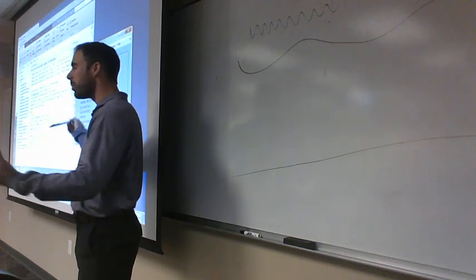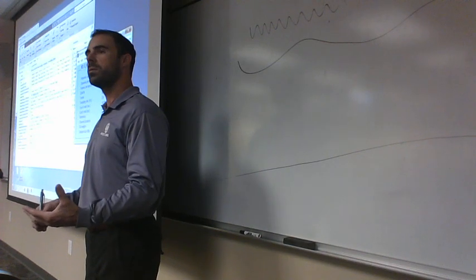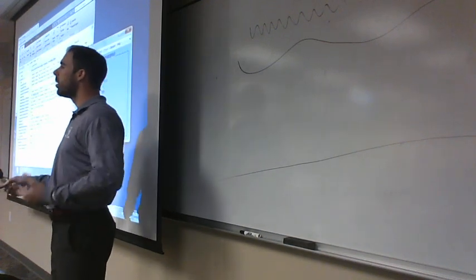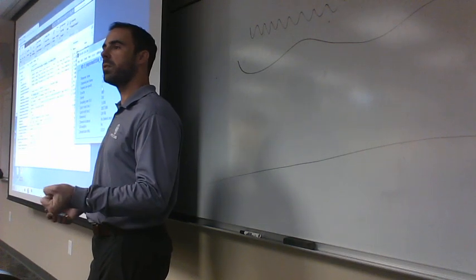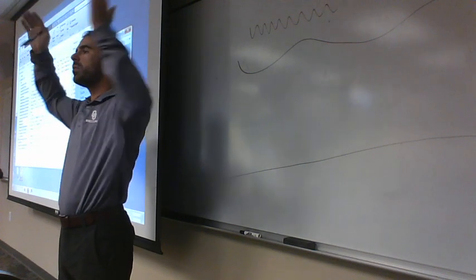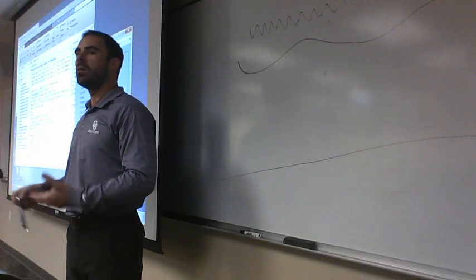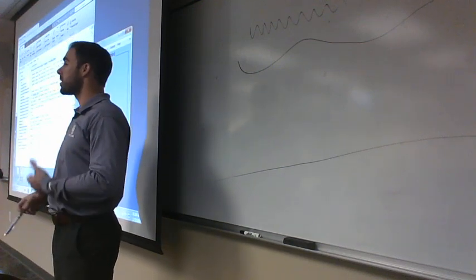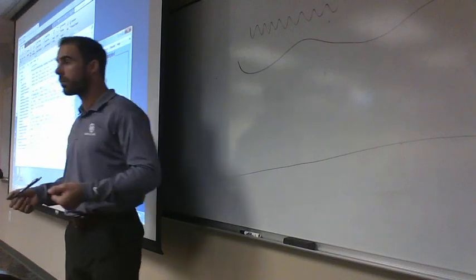We're looking at it right now with this data. We want to know what's happening in the brain during different times of cognition. When we're remembering, when we're forgetting, all these different types of things. We want to be able to look inside brain activity and figure that out. And if you just have one big long stretch, that's not going to tell you anything. We need to slice it into different times so we can categorize that activity based upon the different types of cognitive phenomena that are actually occurring. Does that make sense? Okay.